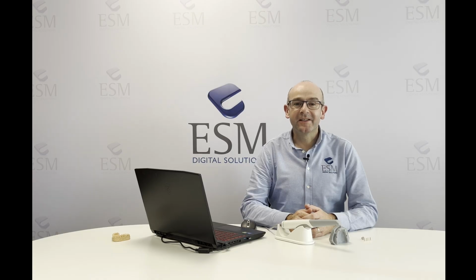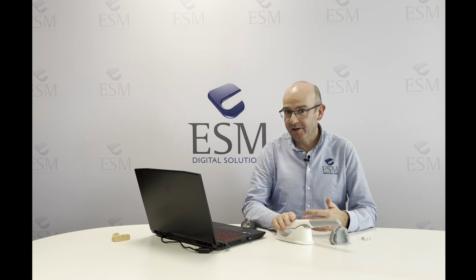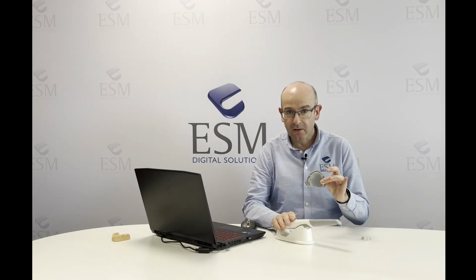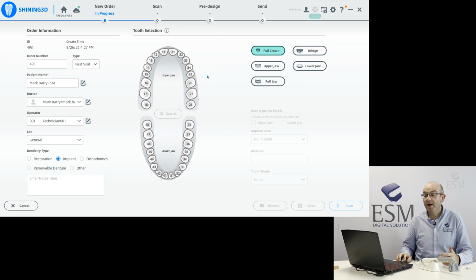In this video, I'd like to present the full arch workflow using the Shining 3D Aoral Scan 3 intraoral scanner. In this workflow, we're doing a conventional digital workflow. So we're using conventional scan bodies, and I have typed it onto here with 4 implant positions that we're going to work with. So first of all, we're going to set up the workflow on screen.